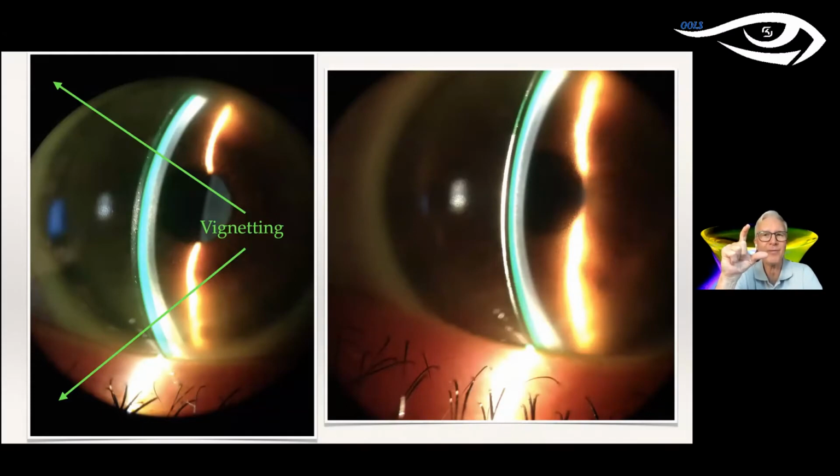It doesn't magnify the image, but it enables that image to fill the screen of your cellular phone, and therefore you get rid of all this vignetting. So it's kind of an amateur mistake not to do that. So easy to do. Change the magnification on the screen face before you take the picture.